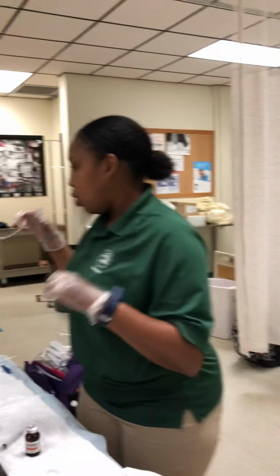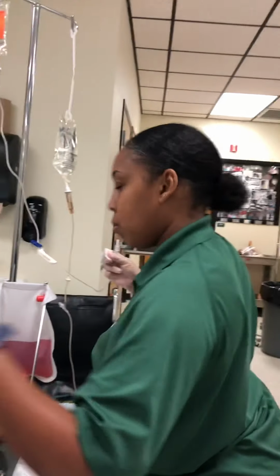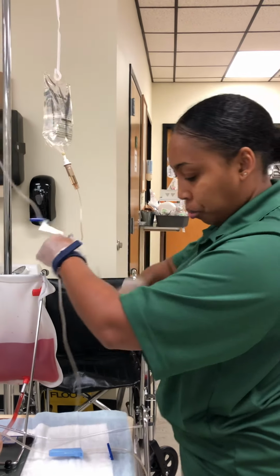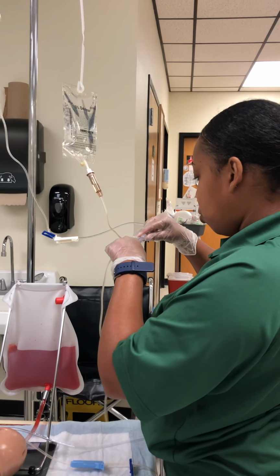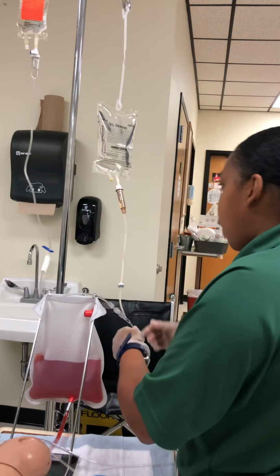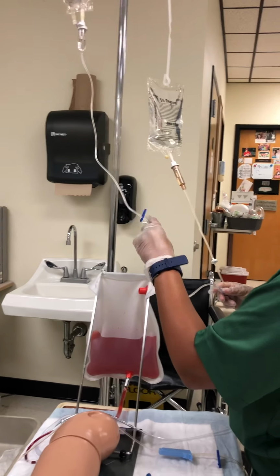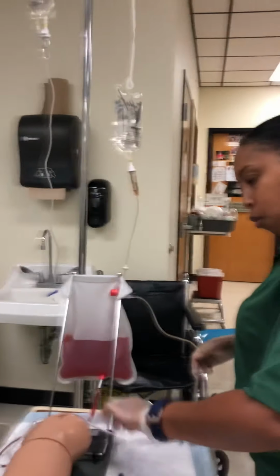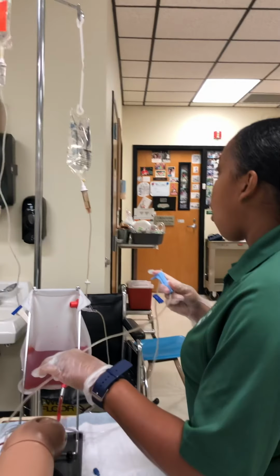And I'm gonna clean the port closest to the primary IV bag. And we're gonna clean it for 30 to 60 seconds. We're gonna attach. And now we're gonna open up our secondary tubing. And we're gonna regulate it with our primary. We have 17 drops per minute.